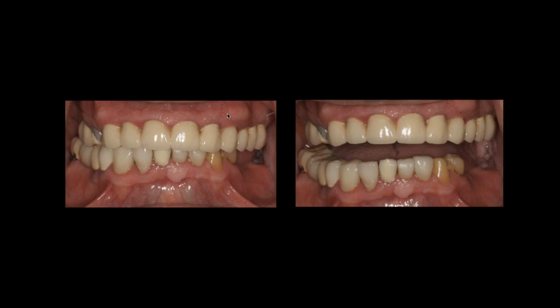Meaning that we didn't understand how to mask the metal that was there from the inside, or how to layer it with enough opacity on the inside to mask and allow the light to slowly come in from the translucent point of view to the inside of the restoration. So I don't blame this on the material choice. I really just blame it on our knowledge of how to utilize the material.